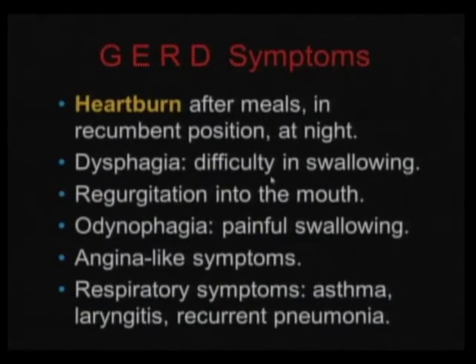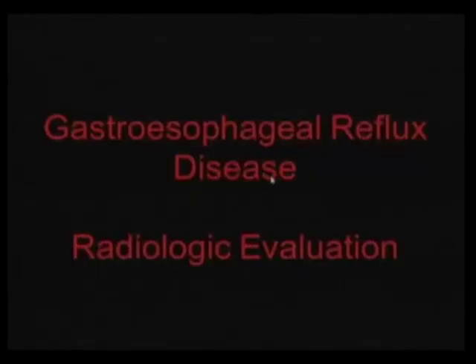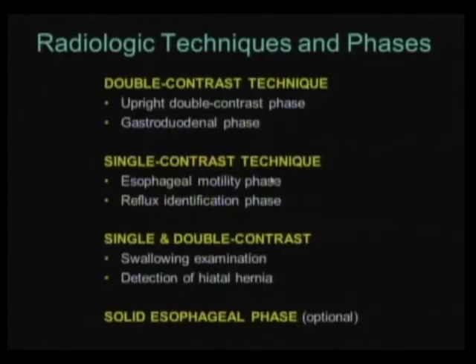These are the symptoms. I'm not going to discuss them, but this one is the most frequent after meals. So how do we perform the radiographic evaluation of a patient that we suspect has gastroesophageal reflux? We perform a biphasic technique, that is a double and single contrast examination of the esophagus.